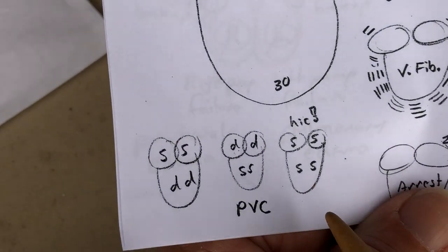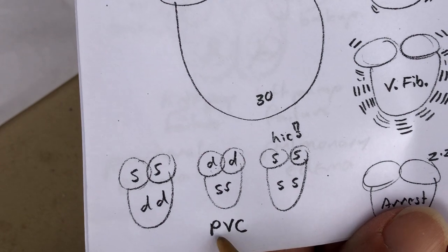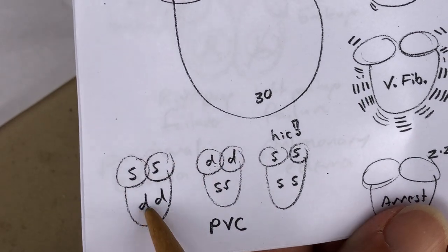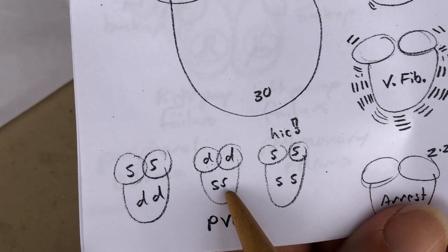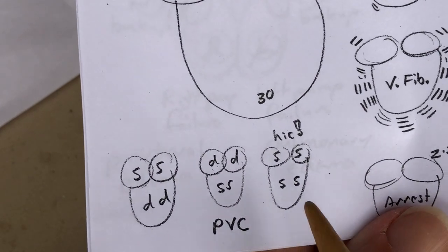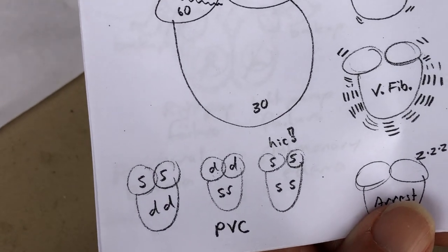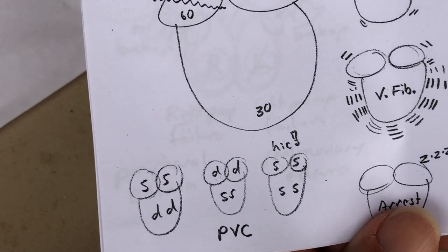Here's something else to look at before we throw this thing away. PVC, standing for premature ventricular contraction. It's supposed to be both atria contract while the ventricles are relaxing. Then both atria relax when the ventricles contract. But sometimes you'll get a second contraction. And that second contraction is sort of like a hiccup in your heart, or it's sort of like your heart is skipping a beat. The main thing is it messes up the efficiency.